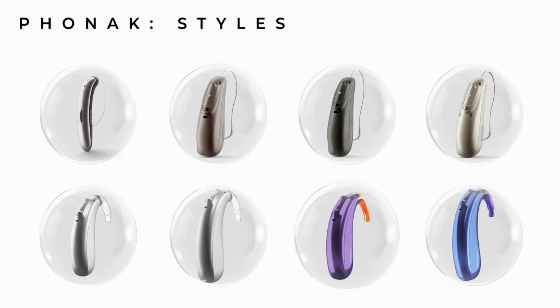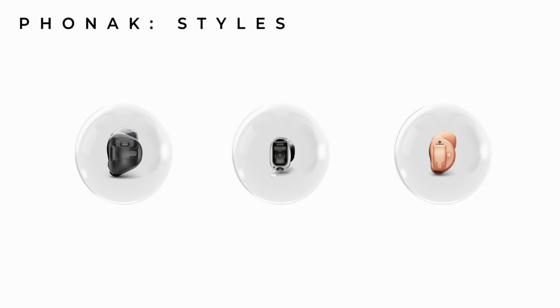Now, similarly to Oticon, there are limitations on the custom models, but it can be enabled on their smallest titanium model as long as it has a program button. As with all other manufacturers, the tinnitus feature needs enabling by your audiologist on Phonak's target hearing aid fitting software.